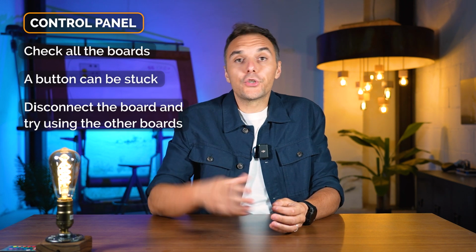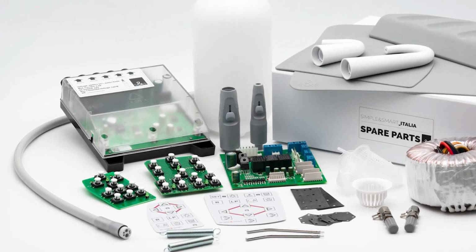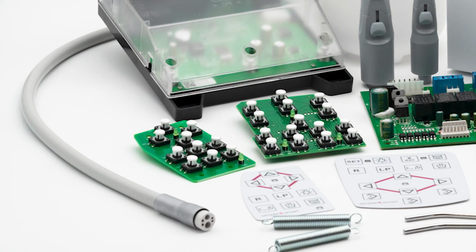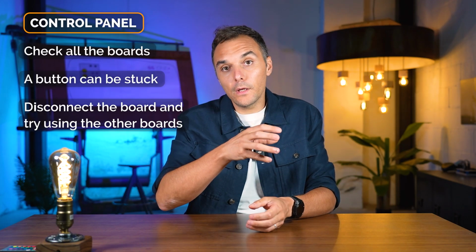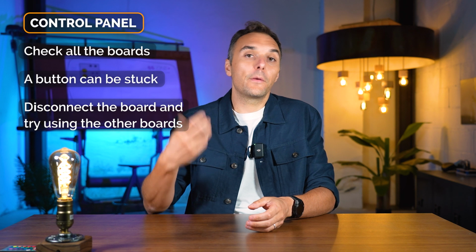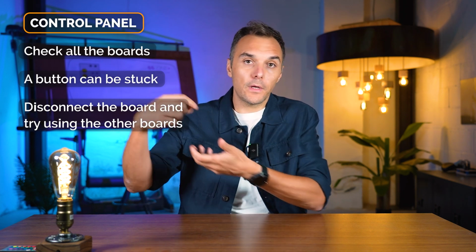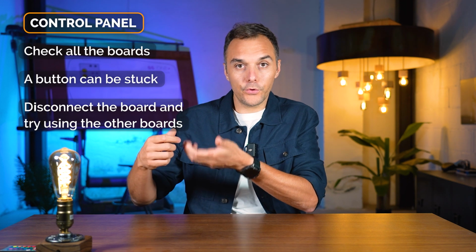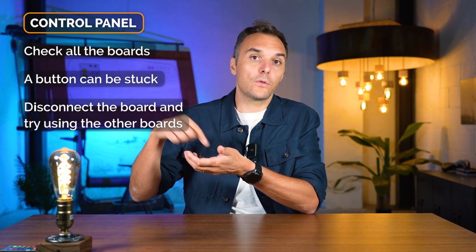When you do this operation, in case you have spare parts, it's also easy to disconnect and connect the spare part without removing the old board and replacing it with the new board. You can even do it outside. So you remove the connector, put it in the board that you have in your hand, and then you can press the button from there.